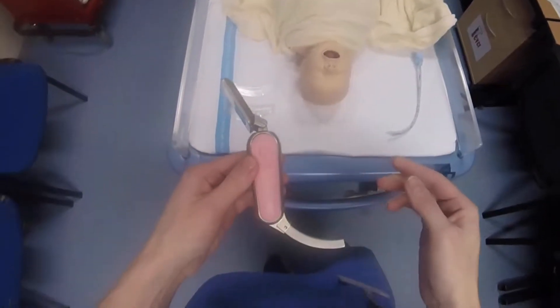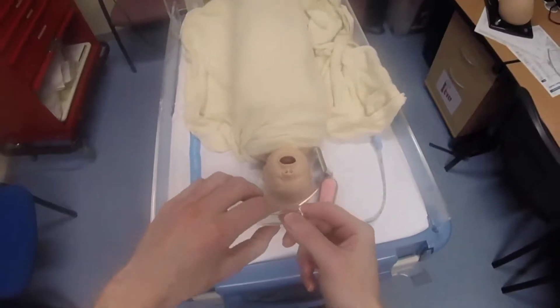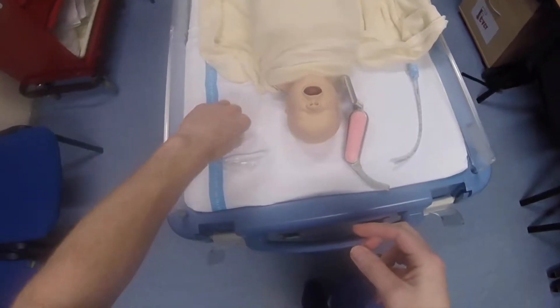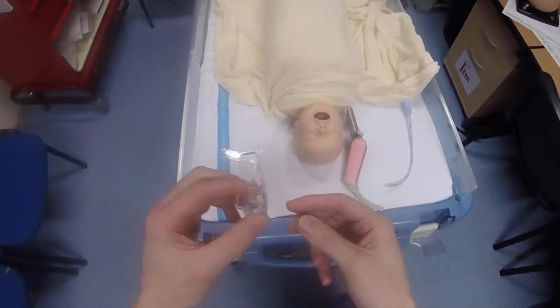This is the paediatric version and it has two blade sizes. It has the N size, which is the equivalent of a Mach 1, and it has the small size, which is the equivalent of a Mach 2 blade.